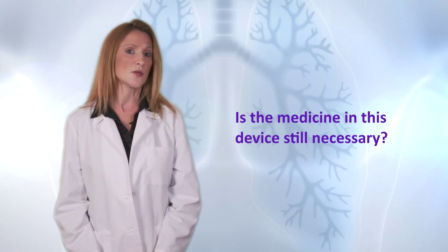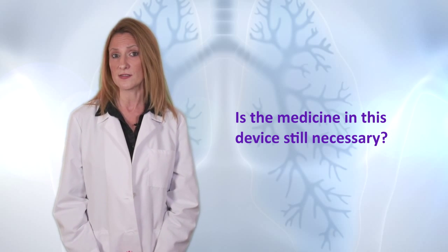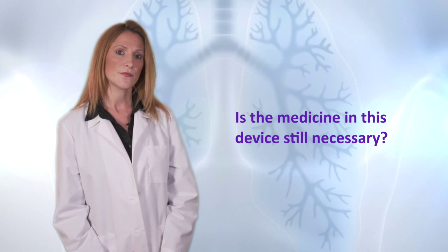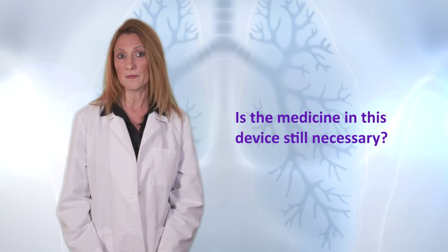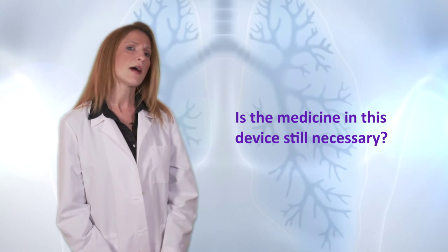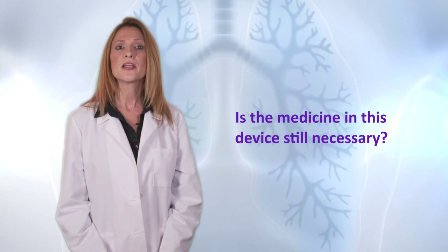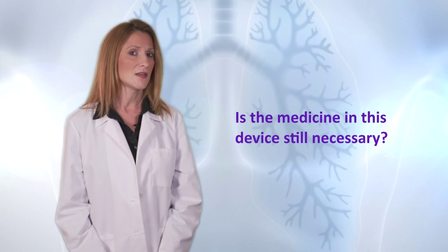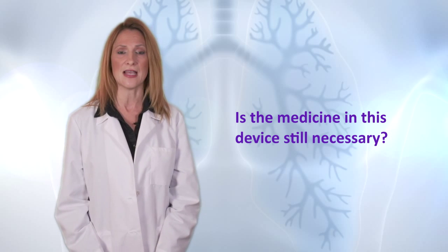Sometimes quick relief medicines are prescribed short-term for wheezing after acute viral or bacterial infections. If that condition has now resolved, the medicine should be discontinued. If a patient would be using multiple devices, also check for duplicate therapy. Some devices, for example the Diskus and some MDIs, may include a combination of drugs, making duplication of drugs easy to miss. Finally, the patient should be informed if the new medication replaces or is added to current medicines. Commonly, patients will assume they are to discontinue the first medicine when a second is added.